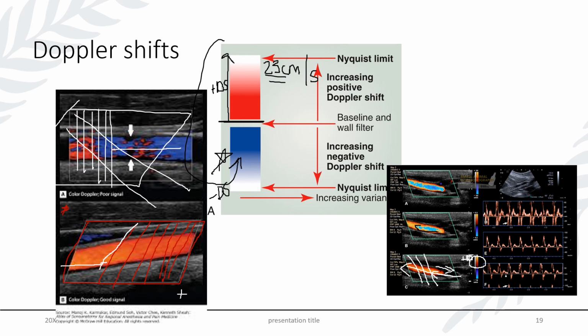You'll see that it's true here in this color flow, here again, and you even notice it in the spectral Doppler as we're getting velocities above what the technologist has the scale set at. We're getting this wraparound, so the peak is being represented below the baseline. So something to be familiar with.